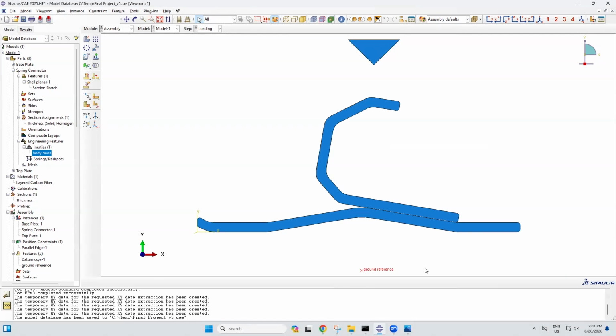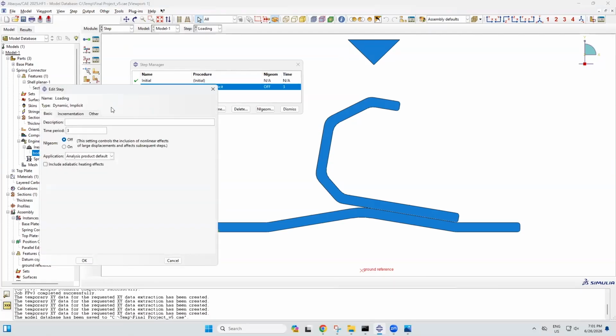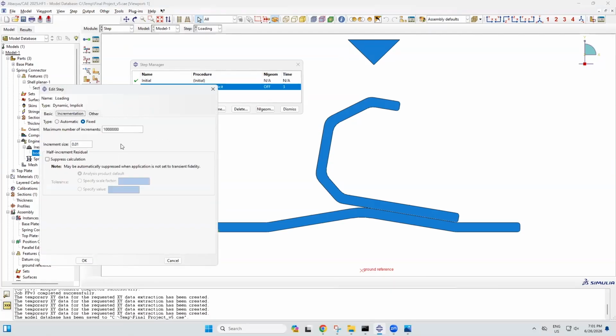I created the reference point, known as ground reference, to assist in unified reaction force measurements at the end and easier creation of boundary conditions. So moving on to steps, I only created one step. I named it loading. Within this step, there is a time period of 3 seconds with an incrementation of 1e7 and an increment size of 0.01 to display the overall animation.